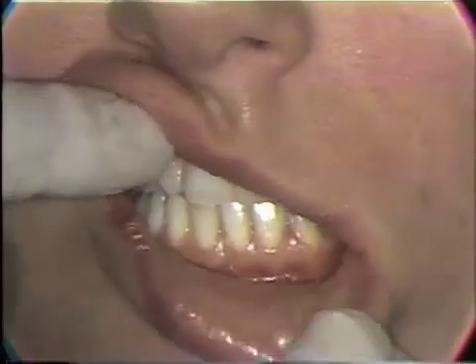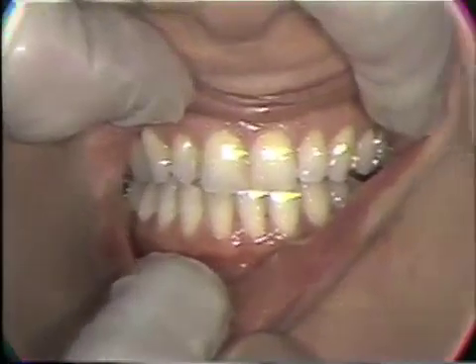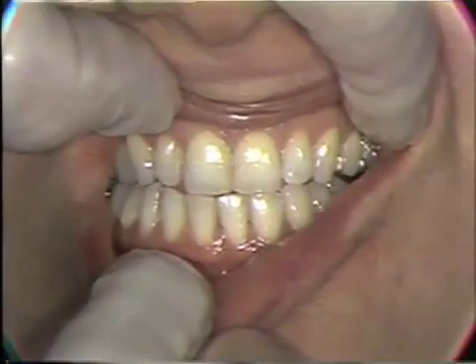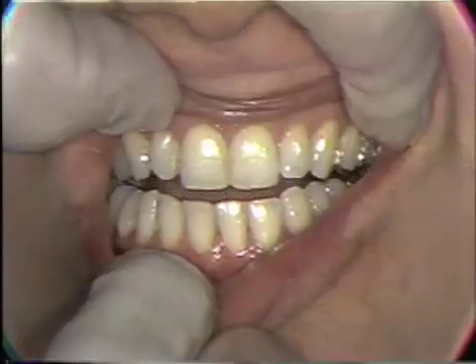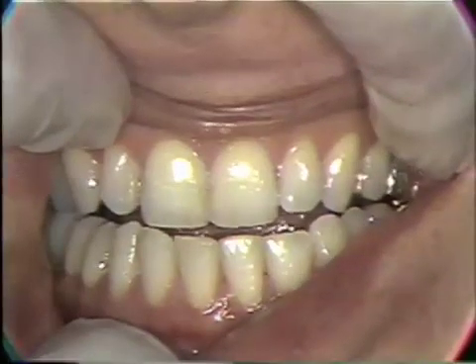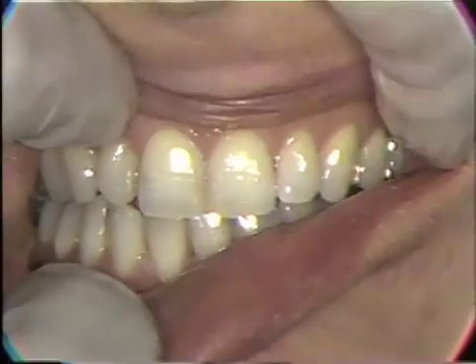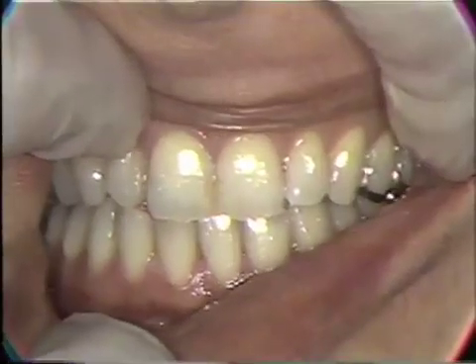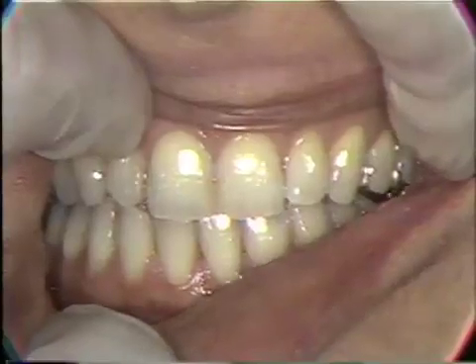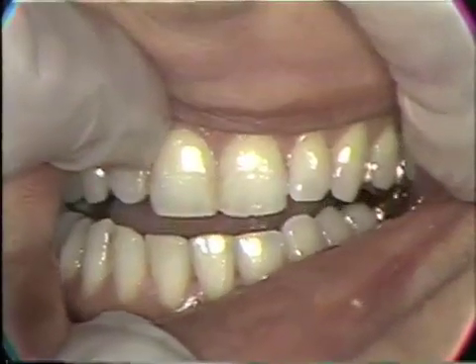The patient opens, puts the back teeth together, then slides straight forward. Notice that is quite a bit forward — well out of functional range. Notice the position where the teeth lose contact and the deviation to the right that is necessary when she protrudes the jaw.